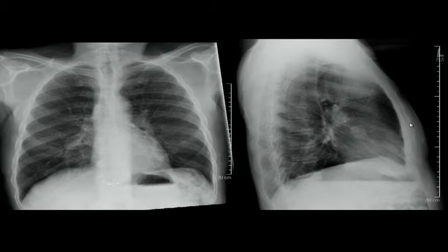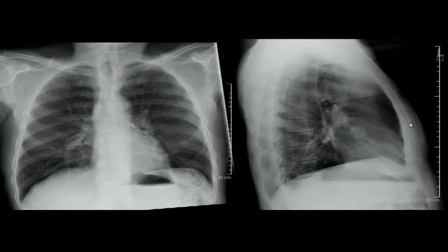It's not a definite border here on this side, so I believe it's confluent with the vasculature, potentially of the hilar region. On this radiograph, it appears to be medial. So a good way to say that would be that along the medial aspect, the mass is inseparable from the vessels, right? So not hilum overlay sign. The truth of the matter is that the hilum overlay sign is positive here.